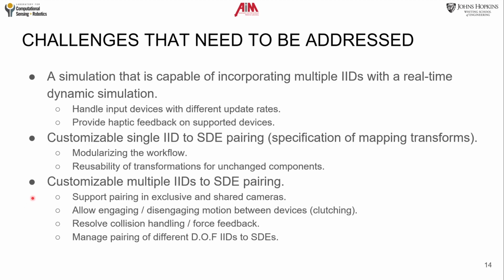Several challenges need to be addressed for a simulation framework that allows multi-user teleoperated control. The first challenge is the architecture of the simulator itself. The simulator must be capable of incorporating multiple input devices with different update rates, with high-speed communication requirements, and be able to generate force feedback.